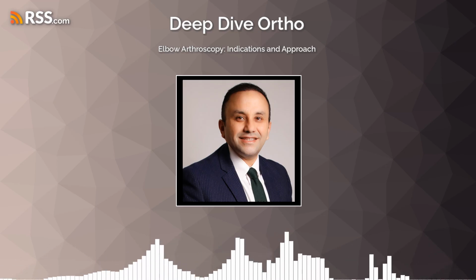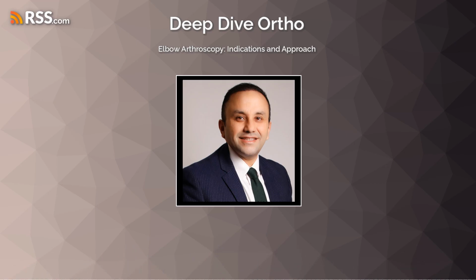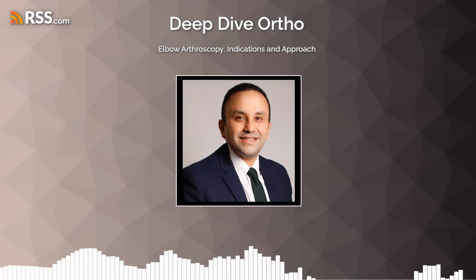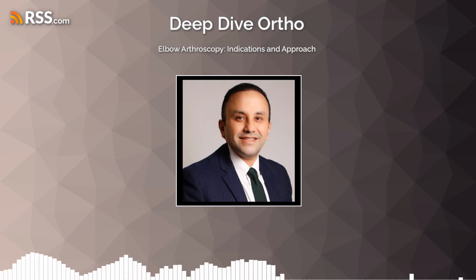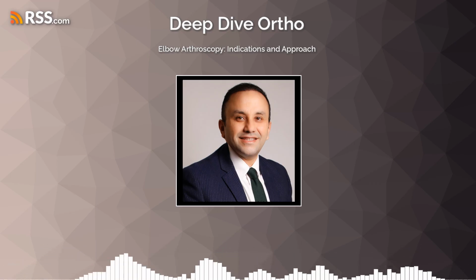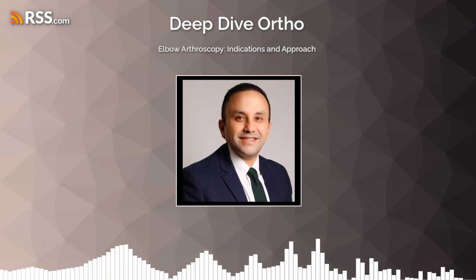So rather than a big open incision, you're able to decompress the nerve with very small access points. How does that work? Is it similar to arthroscopy inside the joint? For the technique, this procedure is typically performed under general anesthesia with the patient in a lateral decubitus position. It is crucial to highlight that this is often a dry endoscopic technique, meaning no irrigation fluid is used. No fluid like in joint arthroscopy. Correct. This avoids fluid extravasation into the soft tissues, a common concern in traditional arthroscopy.